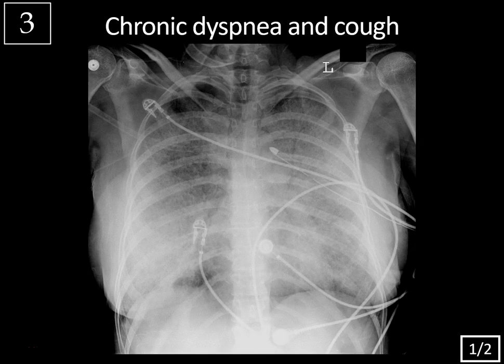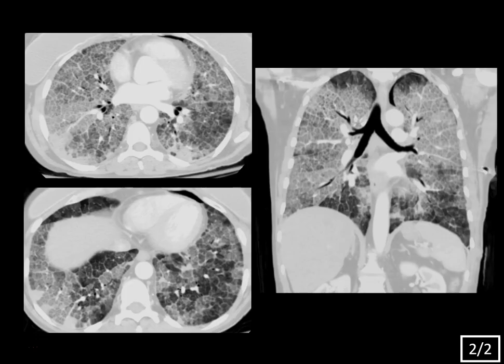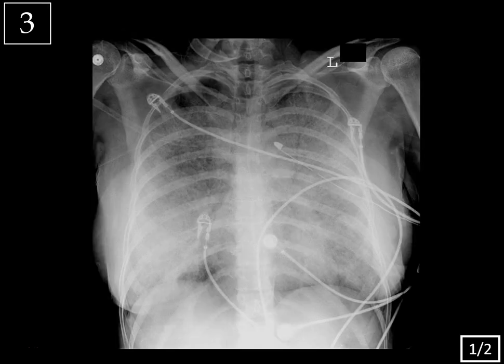Case three — chest X-ray, chronic dyspnea and cough. On this frontal chest X-ray, you see diffuse ground glass and airspace opacities throughout the lungs. This is nonspecific — depending on the history, it could be multifocal pneumonia, ARDS, or diffuse alveolar hemorrhage or edema.